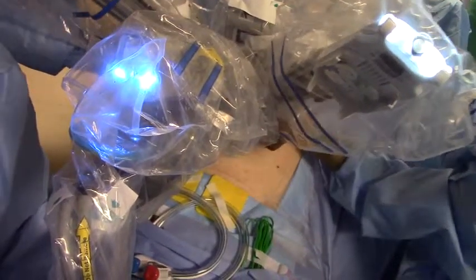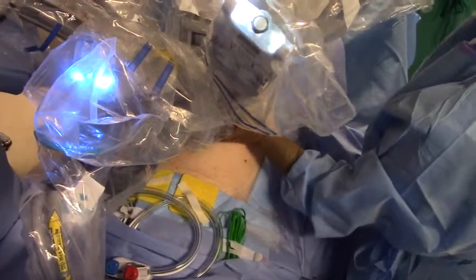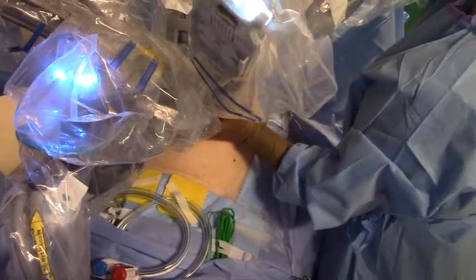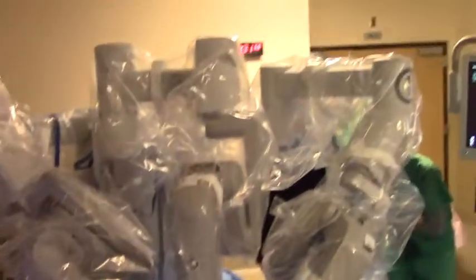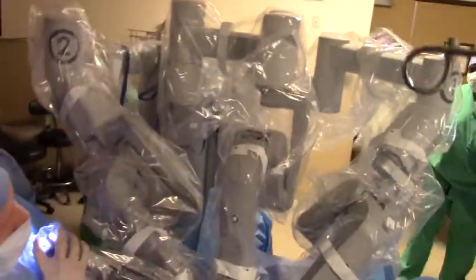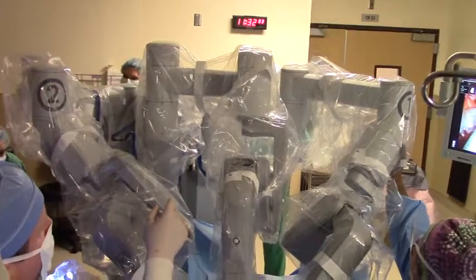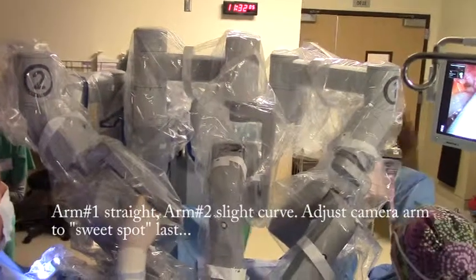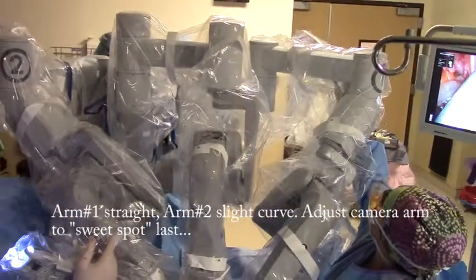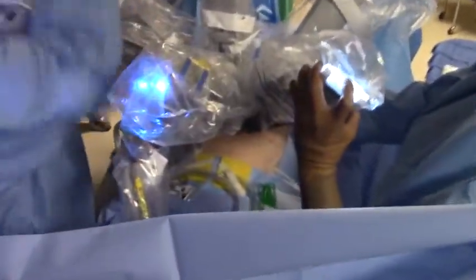You don't do the Frankenstein arms on this one. No — you have to keep them out almost, still almost totally straight on that arm over there. Well, that one's Frankenstein. Your number two is — correct. The two is not. I'm going to take a picture of that. If you need to raise your hand all the way, you can get a better angle. That's completely straight now.